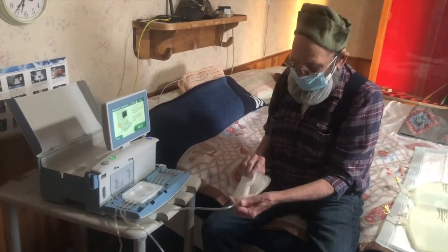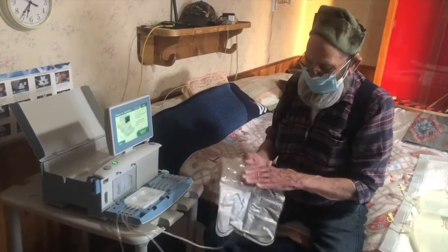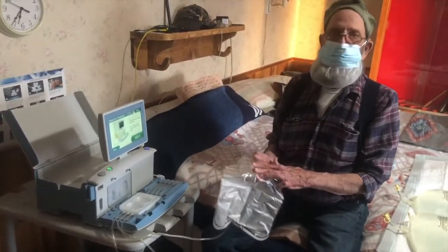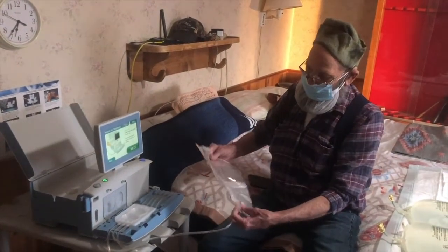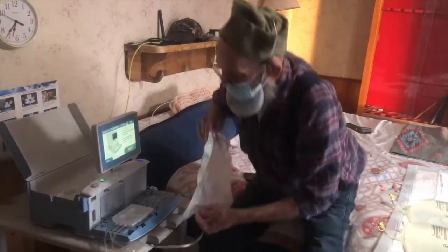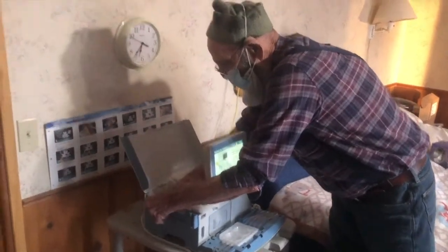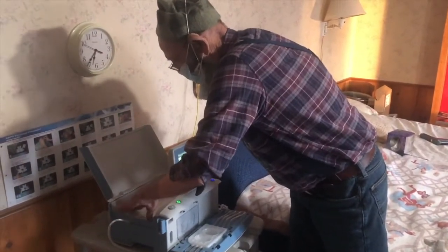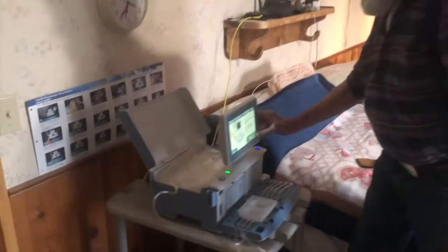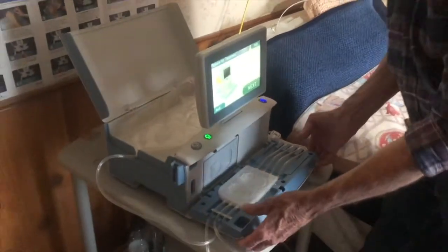Unfold heater bag and place bag in heater tray. Secure the tubing in the guide, making sure it is not twisted. You want the shiny side up, so you can tell that it's working right. And you bring this thing up here and put it in this little notch. Get that all laid back. Then close the front door and heater lid.